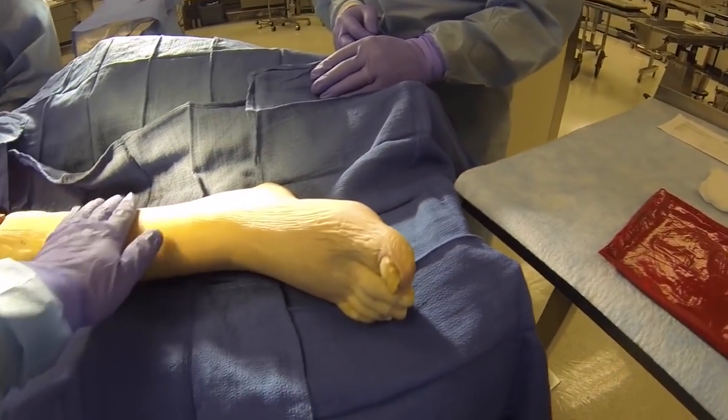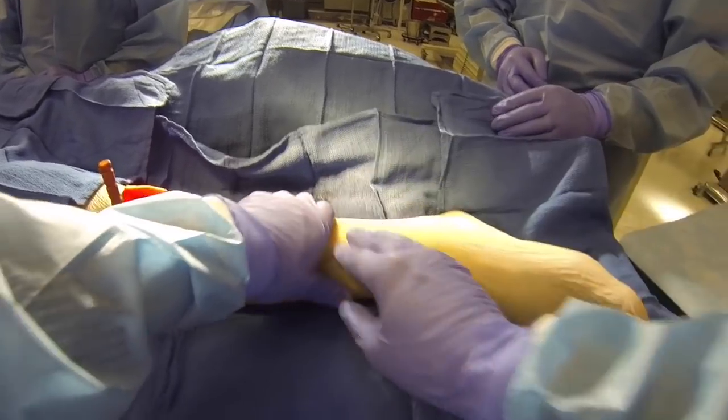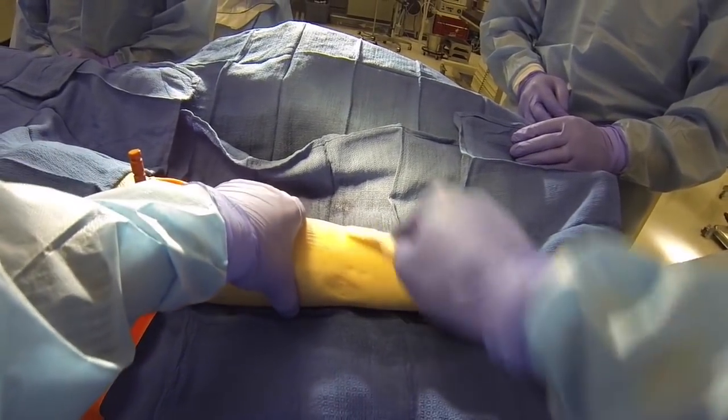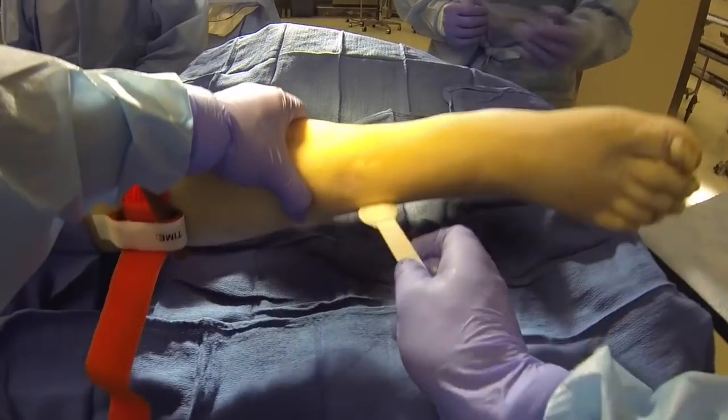Next, select the lowest point on the entrapped limb that's available for you to incise the area. Utilizing your skin preparation material, whether that be betadine, chlorhexidine, or alcohol, make sure you prepare the area and allow the appropriate time to dry.